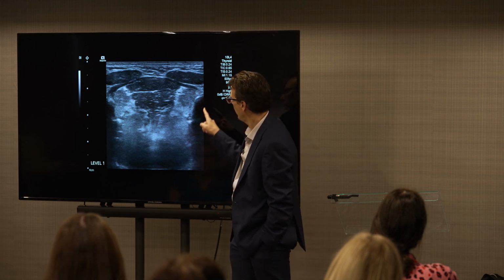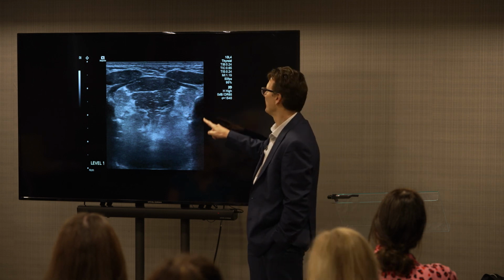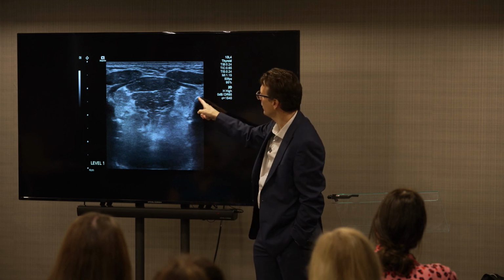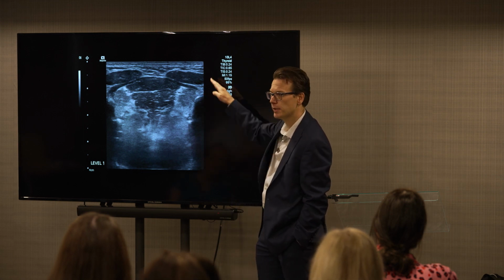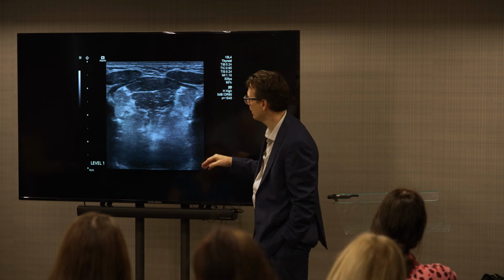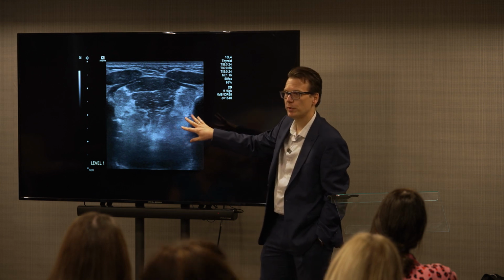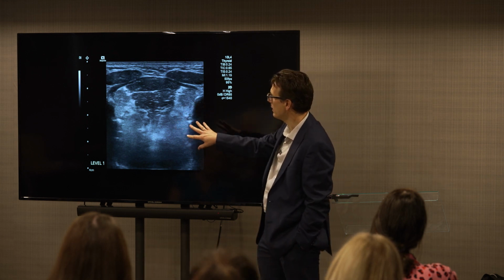That might be important in some of the talks we come across later this afternoon. Hint. Here we have the mandible. Again, you can see the reflective cortex, and then you're seeing shadow behind it because all the sound beams are reflected back towards the probe. So that's what you want to be seeing when you're practicing in your session later.